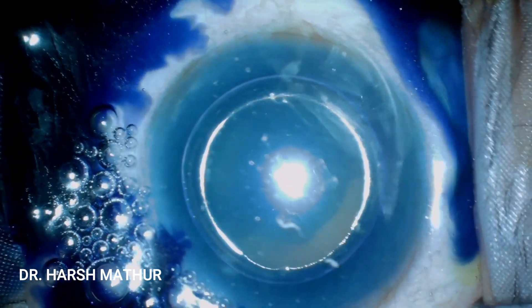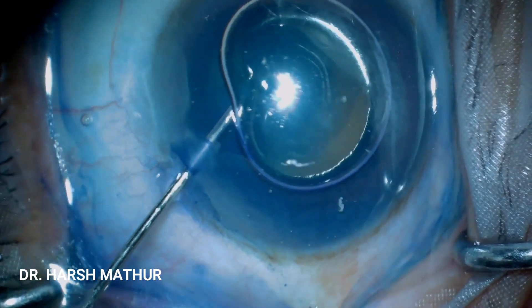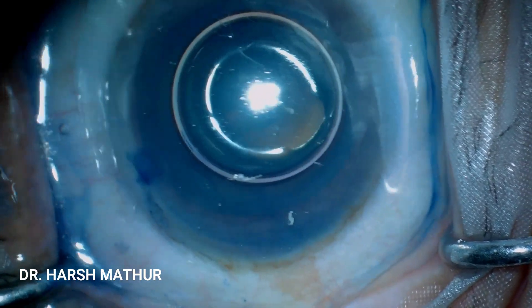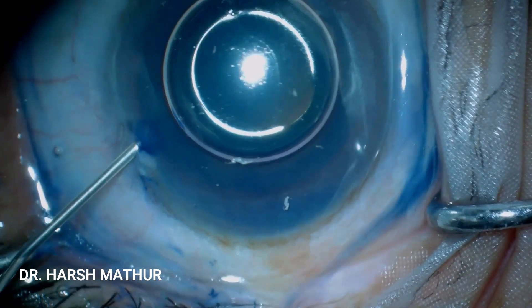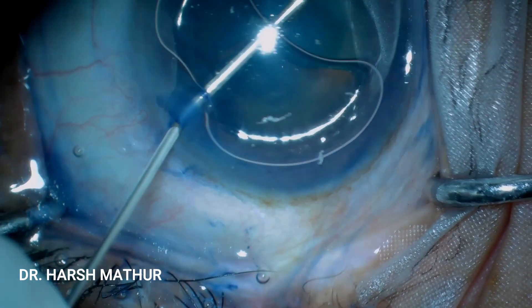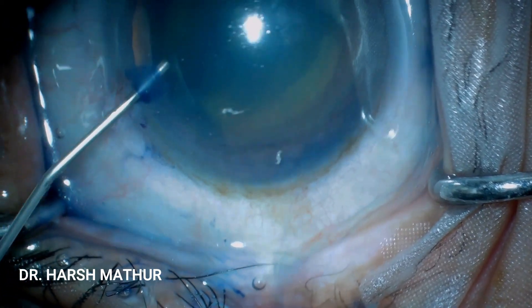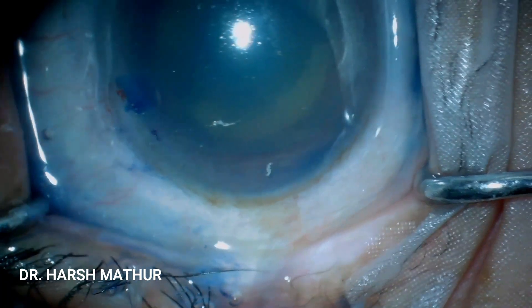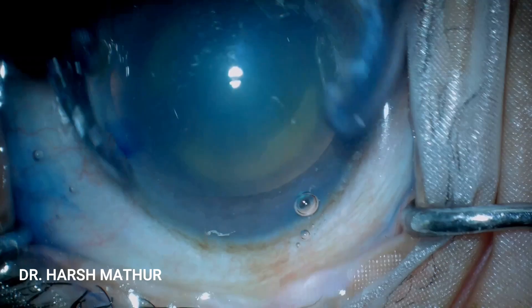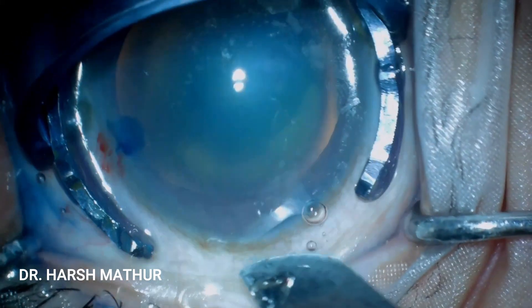There are various ways in which we can correct astigmatism. One is the LRI — Limbal Relaxing Incision — wherein we give arcuate incisions over the cornea. The second is Toric IOLs, which are becoming very popular these days but cost is a major limiting factor. Today we are discussing the opposite clear corneal incision, which was introduced by Lever and Hand.